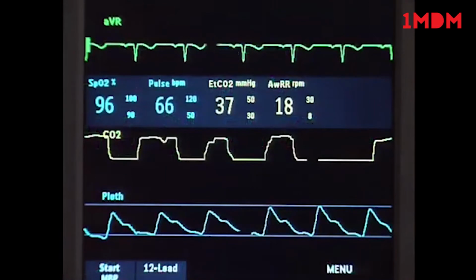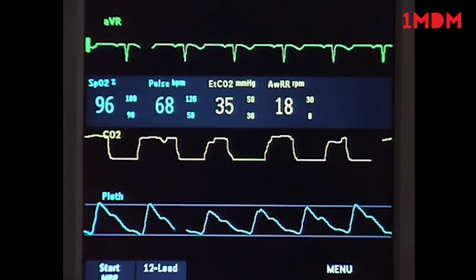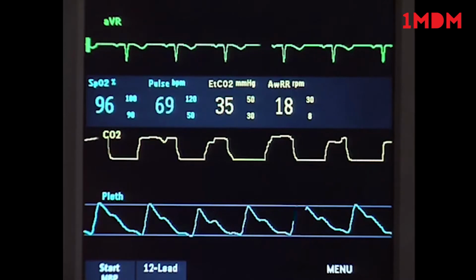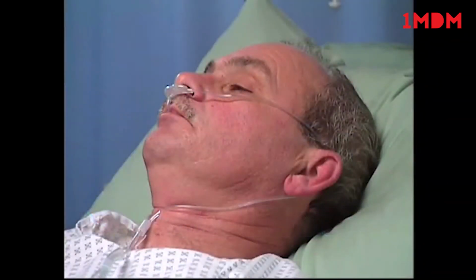The MRx can also measure carbon dioxide or CO2. Philips uses the microstream method of sidestream CO2 measurement. The first step in setting up the microstream system is to select the appropriate filter line. There are 5 factors to consider when selecting the filter line. Patient situation: ventilated or not ventilated.